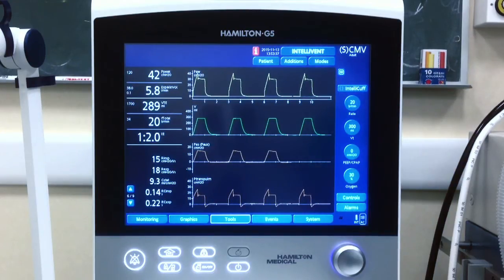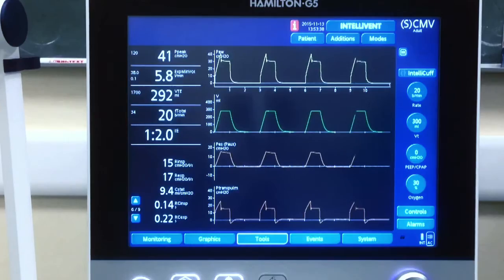In this screen we have airway pressure, volume, esophageal pressure, and transpulmonary pressure.